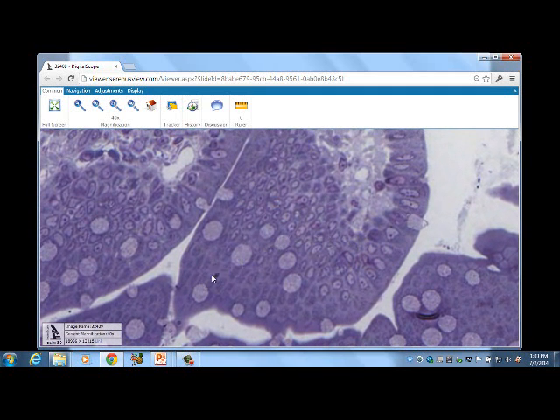Now here we see cuts through the intestinal absorptive cell. If you cut at the very top, you will see the brush border, and we see the brush border right there. Cut it right in through there, you see these little rods here are mitochondria, and you can see clusters of mitochondria in these cells. This is above the nucleus. If you cut a little lower, you'll be cutting through the nucleus itself, and then go back through some mitochondria again before you get to the lamina propria.